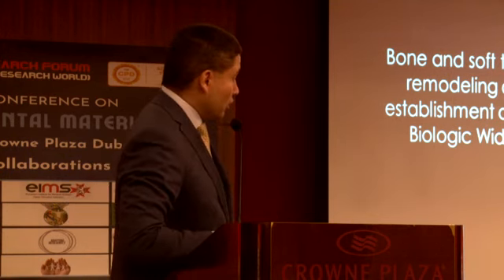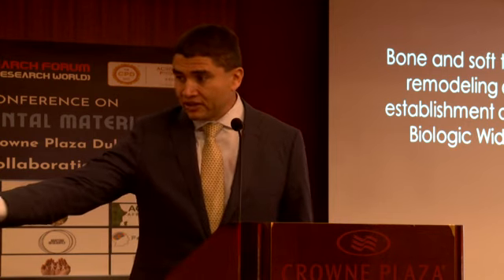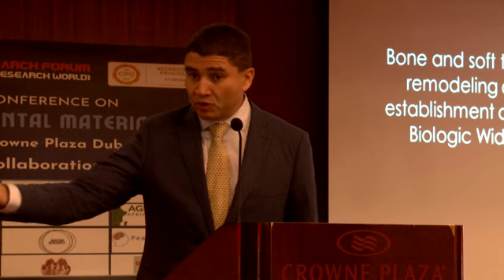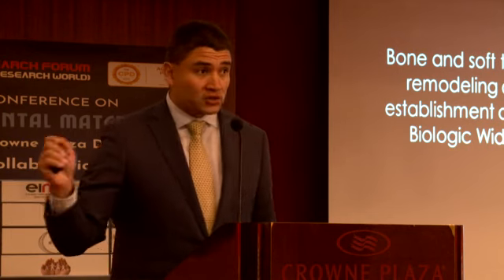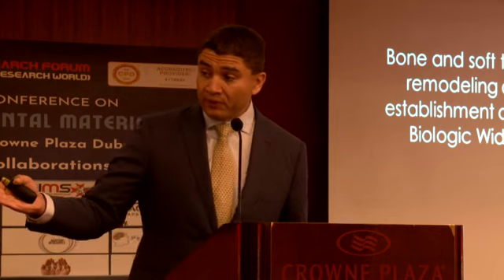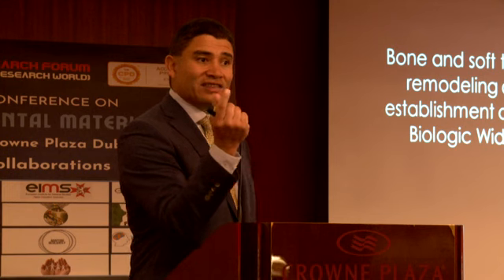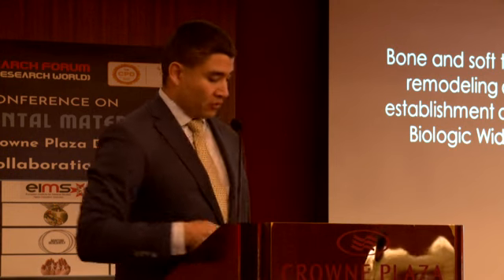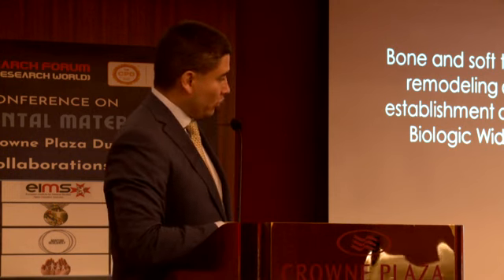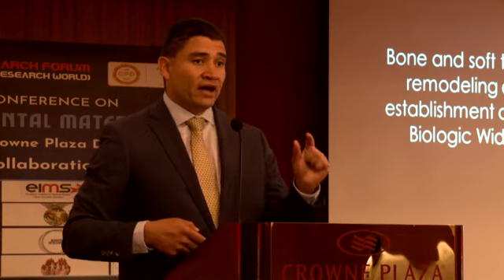The amount of bone present, great talk that you had this morning, by the way. I appreciate it very much because you touched base on this. So what you said very clearly is you pack bone in the gap, right? Why do you pack bone in the gap? To make the thickness of the bone from the buccal plate or lingual plate all the way to the implant fixture; you have to have a certain thickness.